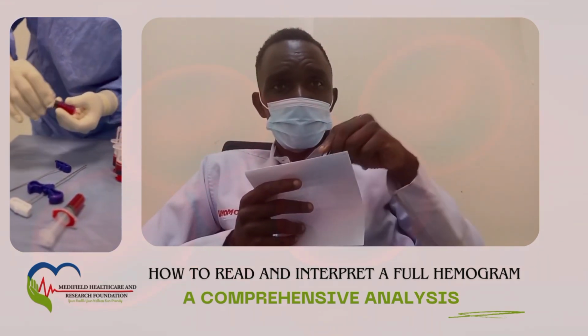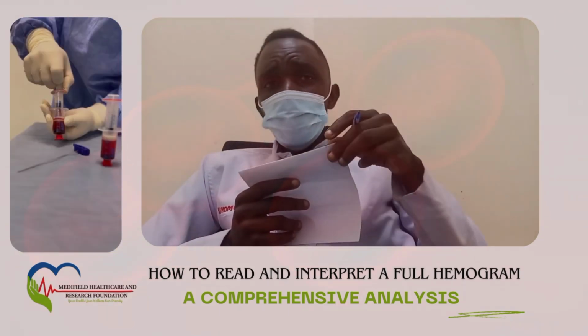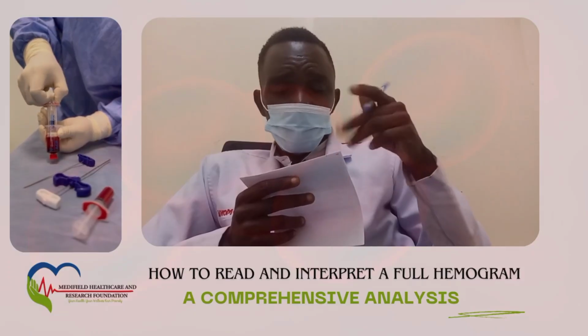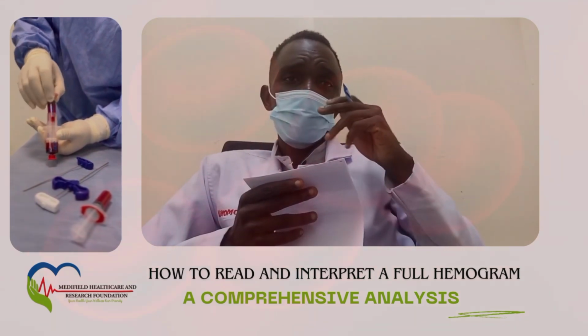A higher count leads to macrocytic anemia. So macrocytic anemia, of course, is caused by liver diseases and lack of vitamin B12 or folate. We'll talk more about this when we handle anemia as a topic. So you can go and refresh your memories of anemia, but for this you have to understand a higher count is macrocytic, a lower count is microcytic anemia.